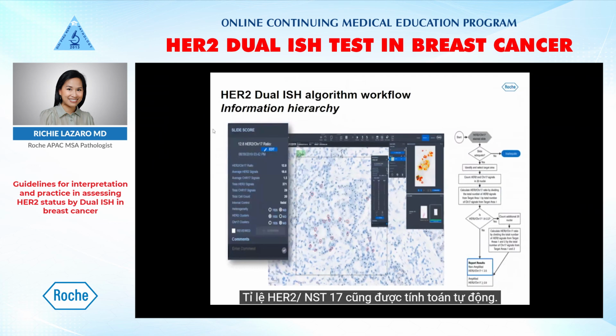The ratio of HER2 and chromosome 17 is also automatically calculated, and the pathologist validates the other HER2 information: the presence of heterogeneity, the presence of clusters, and whether or not the internal controls were valid.